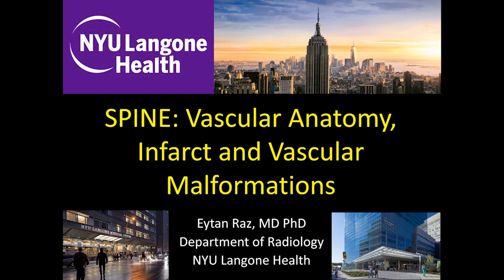Hello, I'm Eitan Raz. I'm a neuroradiologist and neurointerventional radiologist at NYU Langone Health in New York. I will talk today about a few things related to spinal cord.